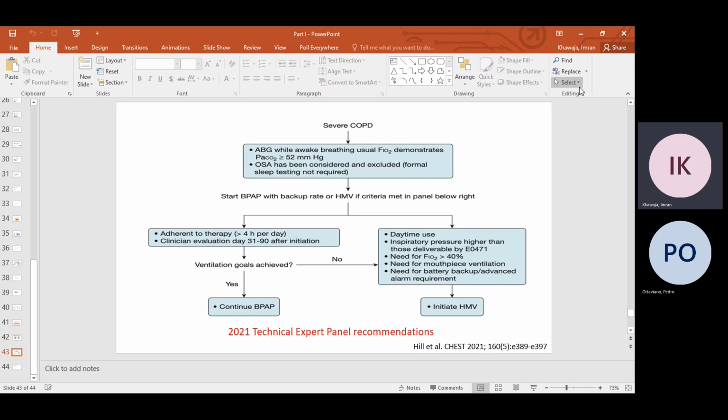So when you guys run with me, you'll see me having a lot of resistance to giving patients non-invasive at home. I always want to repeat it again as an outpatient, especially if I believe there's a multifactorial component, right? You have a patient with ARDS, COVID, intubated for 5 days, diarrhea, lactic acidosis, AFib with RVR and ischemia. Also, they were put on non-invasive to prevent re-extubation, and now they're retaining CO2, and that's not COPD, and then you get that consult. So you'll see that we spend a lot of time looking into the reason why, and I usually have a lot of resistance to giving these patients non-invasive.